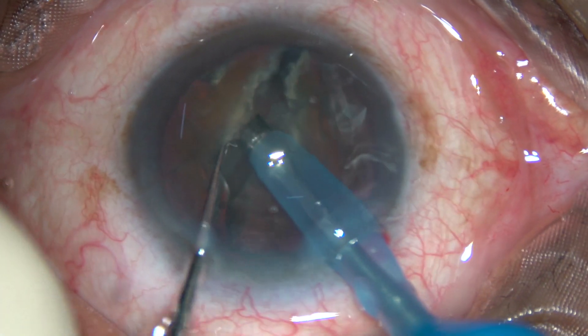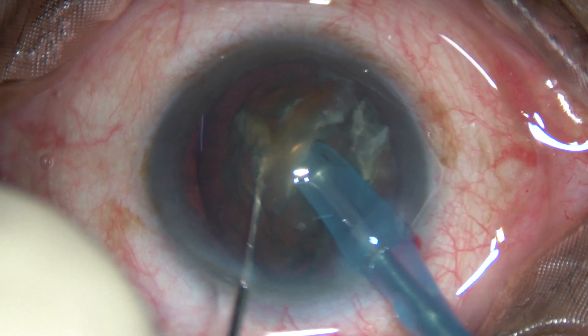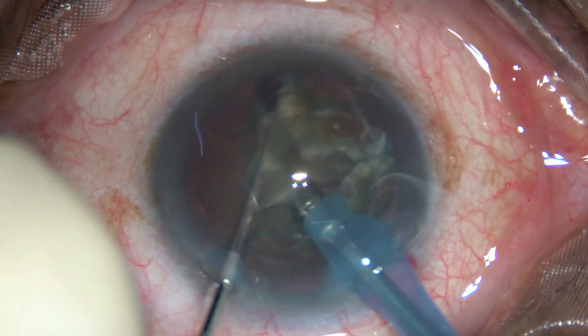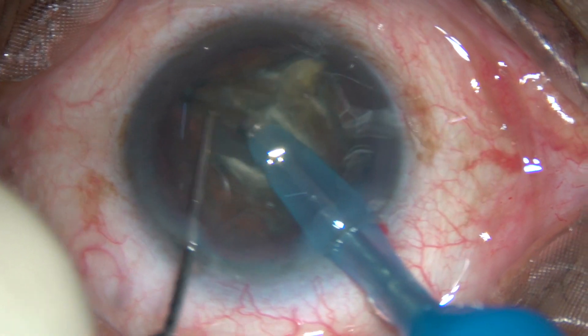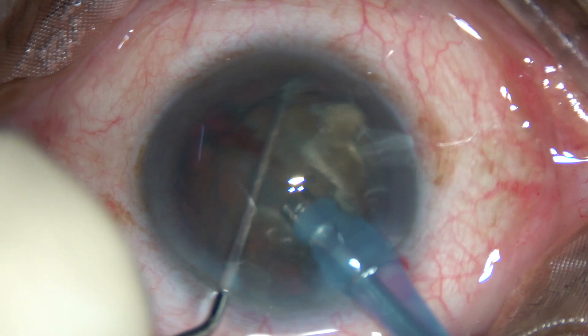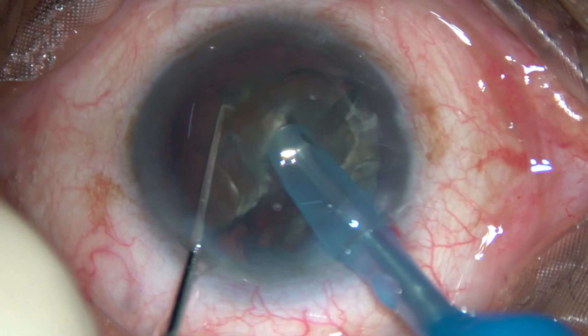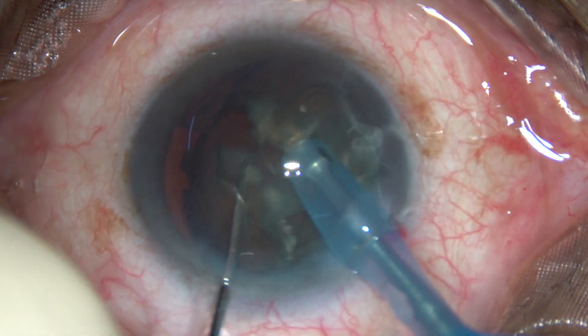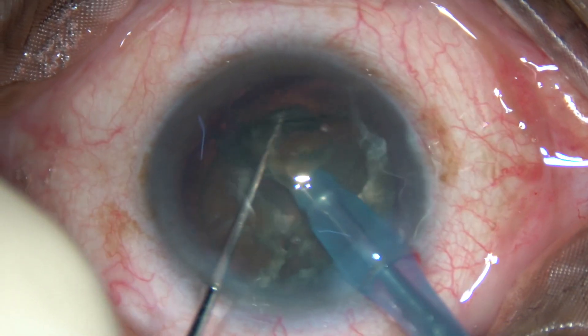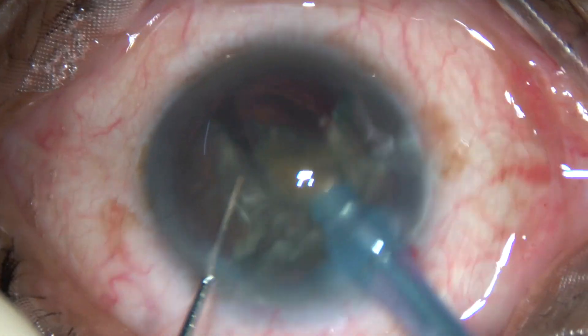Rotate the nucleus, go at a deeper plane through the substance of the nucleus, and chop this hemi-nucleus into two parts. Here you separate the two hemi-nuclei completely. Now rotate it — this is the other hemi-nucleus — go through the substance of the nucleus and chop it. The nucleus has now been divided into four almost equal parts.